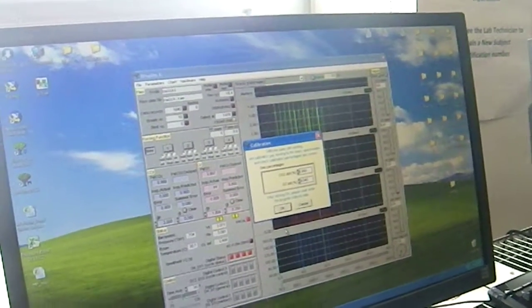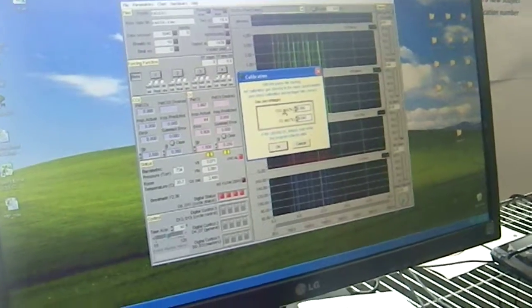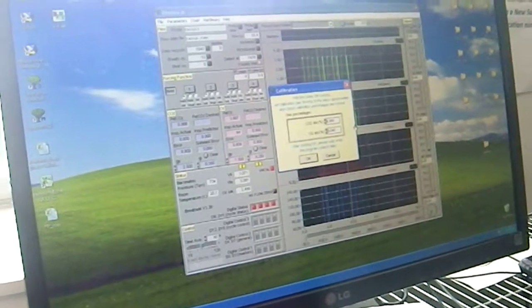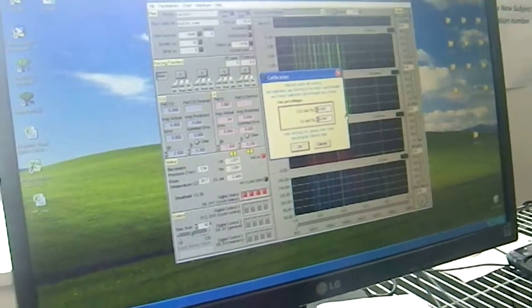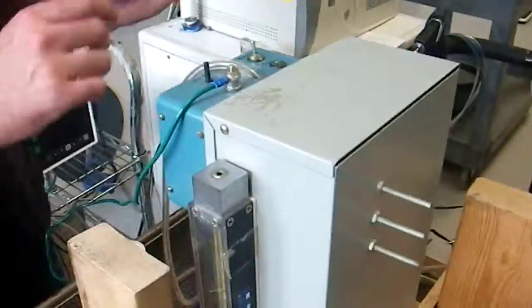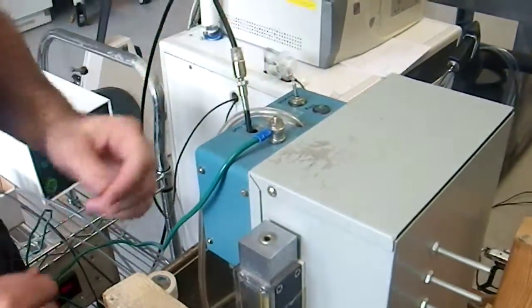Okay. So the next one's going to be the other gas. So this one has oxygen below what you would breathe out and CO2 above what you would breathe out. The point of this is that the computer can use two data points that it knows, and then any gas concentration in between, the voltage coming from the spec, it'll be able to assign a specific concentration to that. So again, it's being measured from the capillary line, but this time it'll be with the calibration gas that's associated with those numbers. So you put this in here, we'll turn on the gas and then let it run.